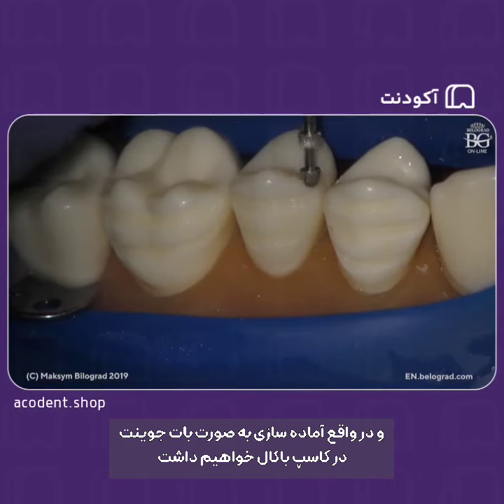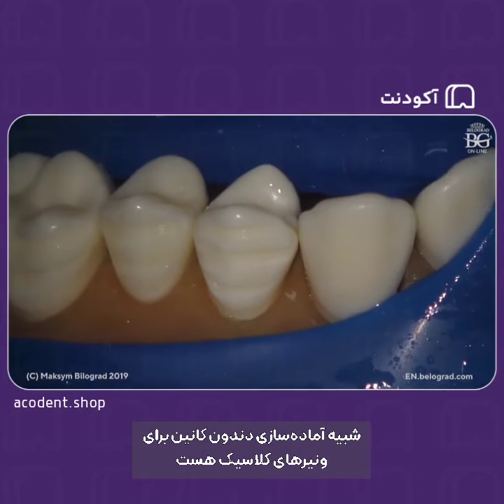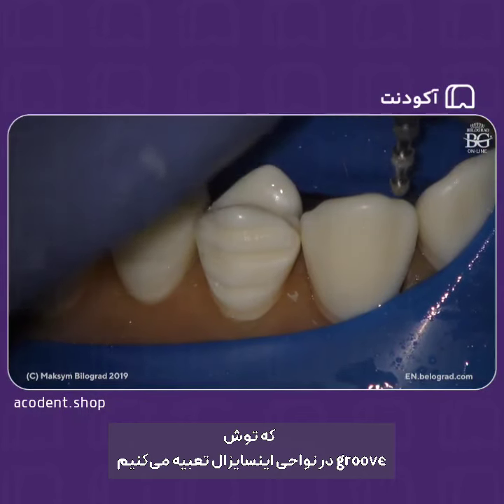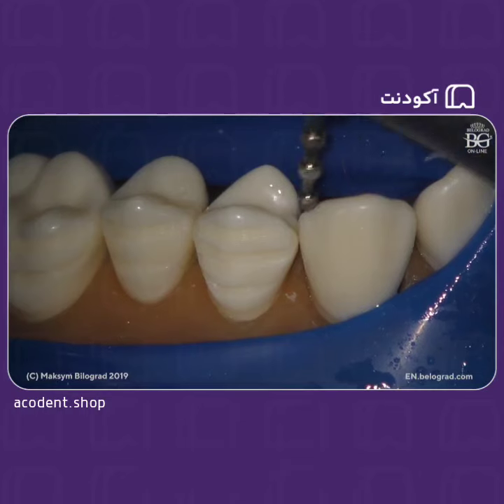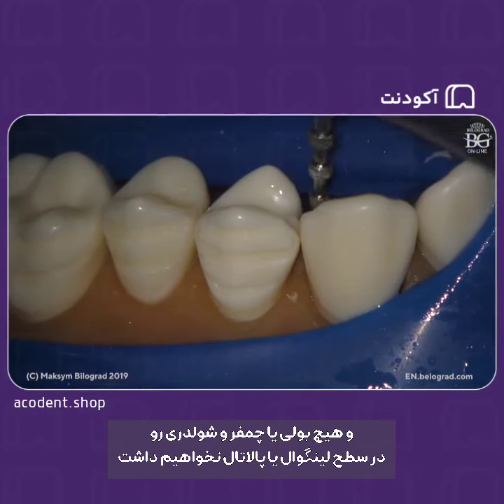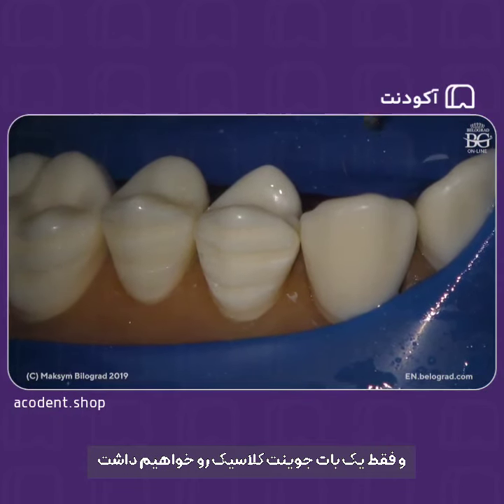Basically, we will do a butt joint over a buccal cusp, and the technique of preparation for this partial coverage is the same as, for example, when we prep a canine for a classic veneer, when you just make grooves on the incisal area and then join these grooves with another burr. So we are not preparing anything from the palatal side. We are not doing any bevel. We are not doing any chamfer or shoulder from the palatal or lingual side. We just do a really classic butt joint.